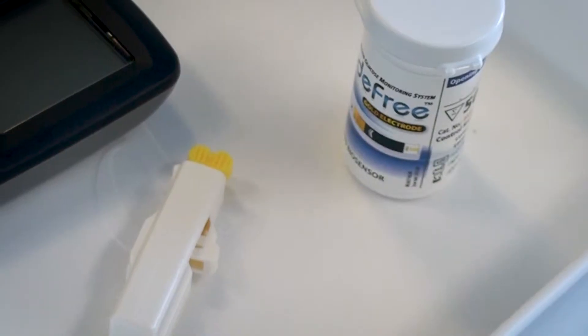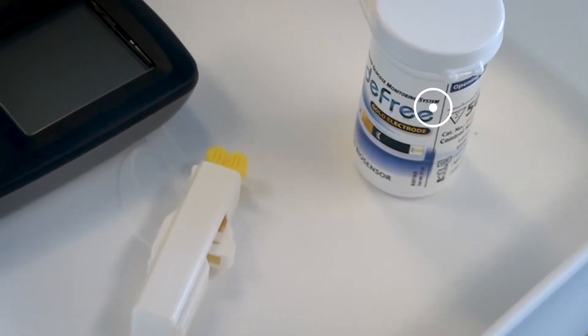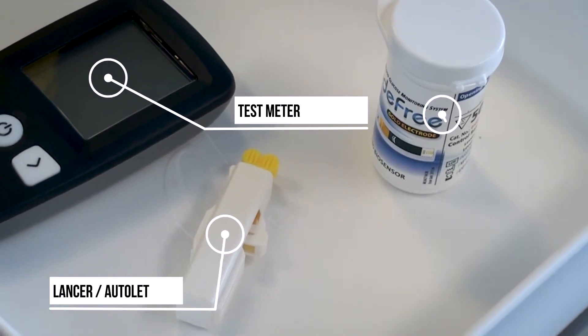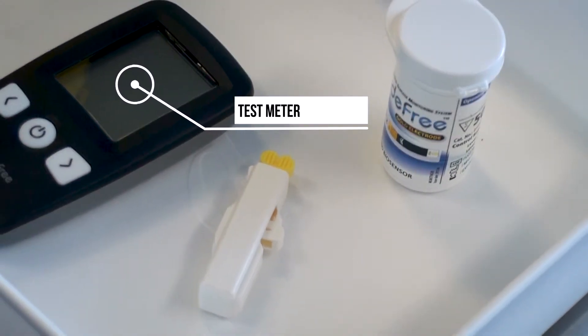You must then assemble the appropriate equipment: the test strips, the lancet or autolet, the test meter itself, a sharps bin, and cotton wool or gauze.